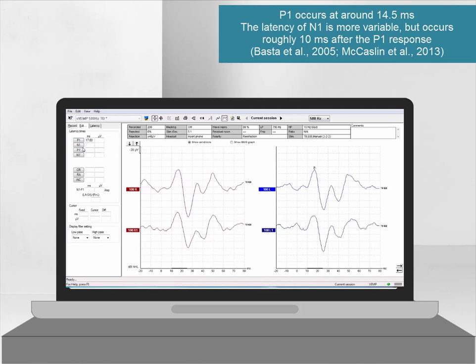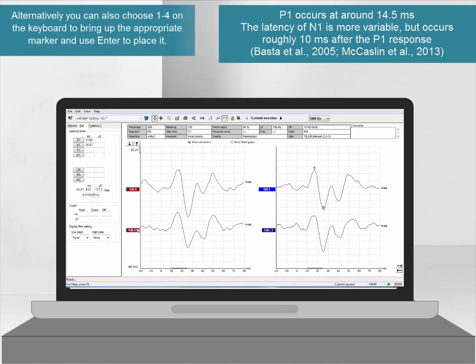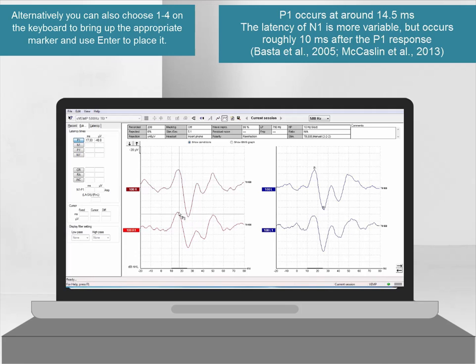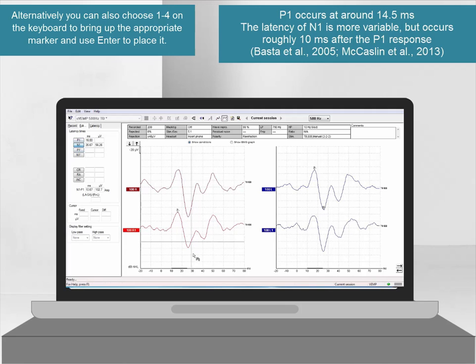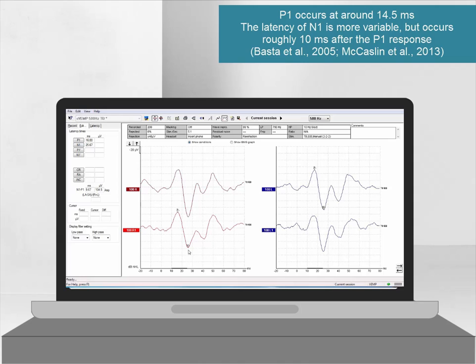It is important to mark both the left and right waveforms. Waveforms can be marked from the record sheet or the edit sheet. From the edit sheet, ensure you have the waveform which you wish to be marked selected. Next, select the waveform marker you wish to plot and then move the mouse over the selected waveform. A left click on the mouse marks the waveform.